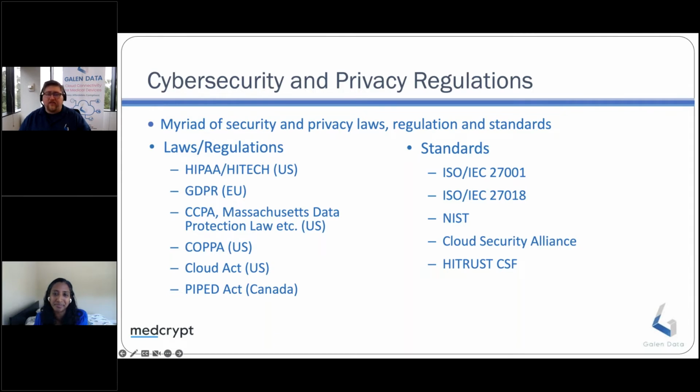And then there are obviously several international standards, the ISO 27001, which tells you how to run data centers and maintain that data, and NIST, HITRUST CSF, which I just want to throw in there.